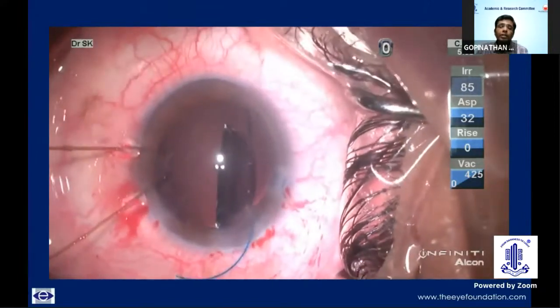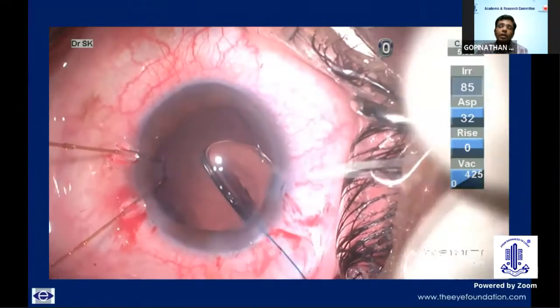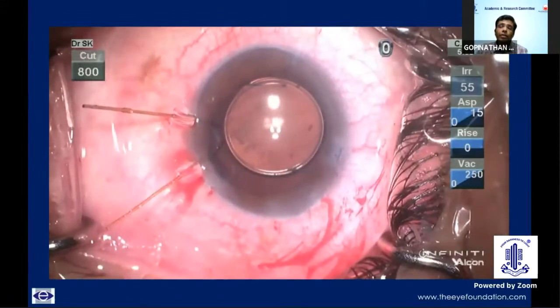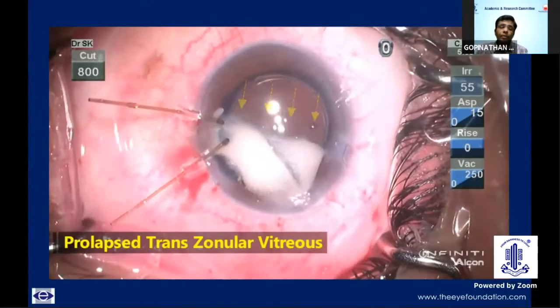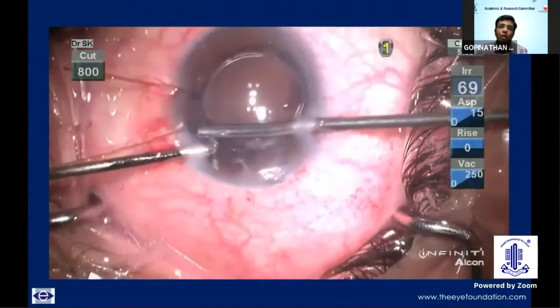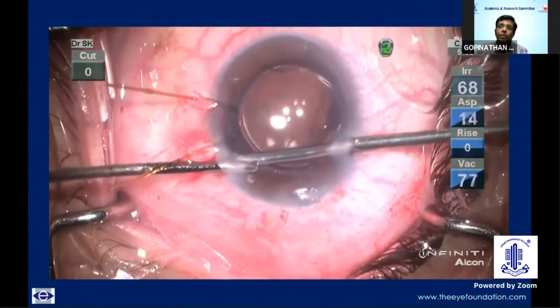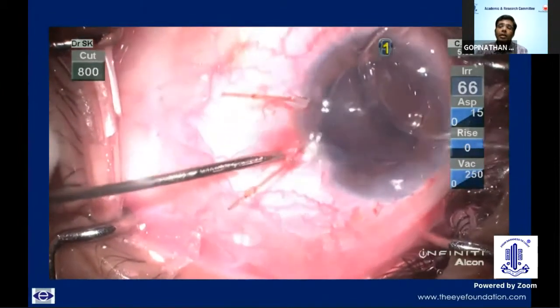Then a three-piece posterior chamber IOL was placed in the bag and dialed into position such that one of its haptics is supporting the area of dialysis. Triamcinolone was then injected into the anterior chamber to stain for vitreous. As expected, there were a lot of vitreous strands coming out from the side port and the main port. A complete but careful anterior vitrectomy was done without injuring the rhexis margin or the iris. Finally, a CTR of size 13 was put in the bag through one of the side ports to make sure the bag is held in position and the dialysis area is adequately supported.